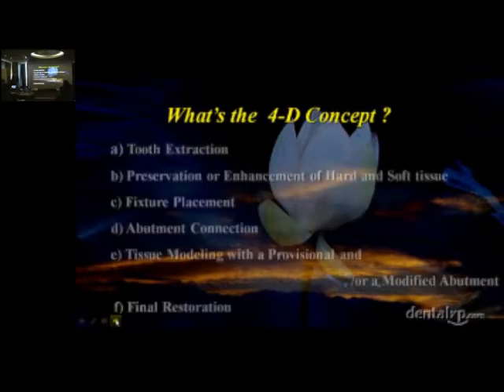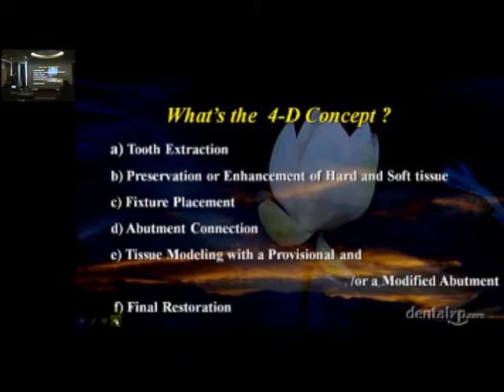Here are the clinical procedures we can list: tooth extraction, preservation or enhancement of hard and soft tissue, fixture placement, abutment connection, tissue modeling with a provisional and/or a modified abutment, and final restoration. For every single procedure, we need to consider the optimal timing.